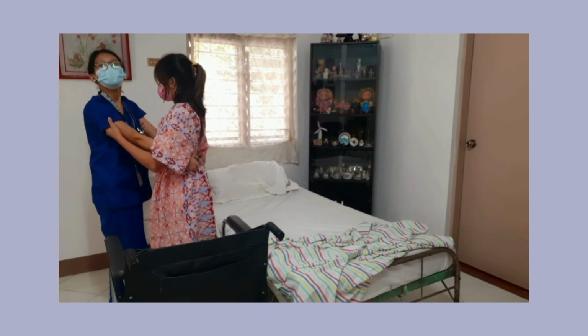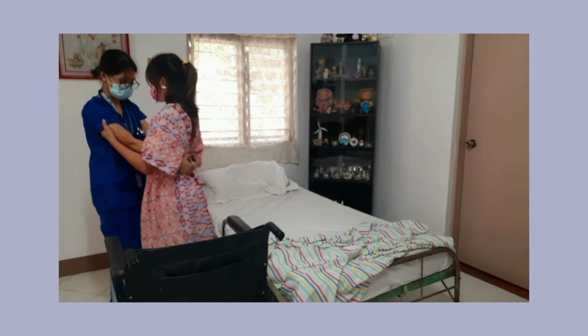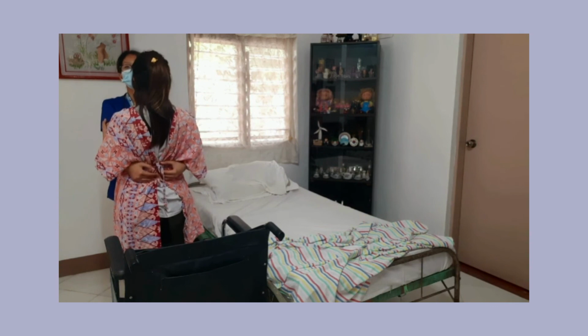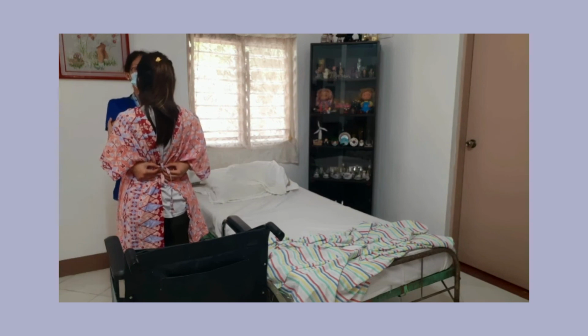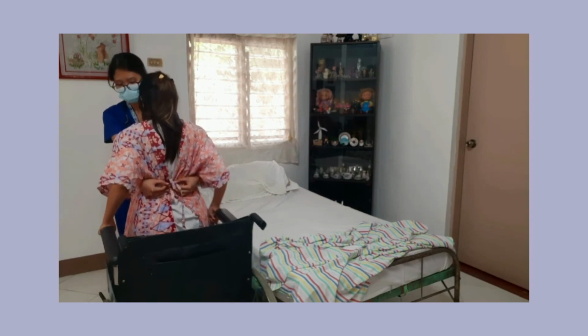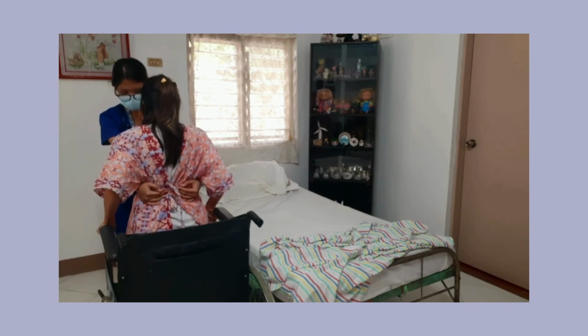Together, assist the client to stand and move towards the wheelchair. Number 9, assist the client to sit. Ma'am, can you please put your hands and arms on the arms of the wheelchair? 1, 2, 3.